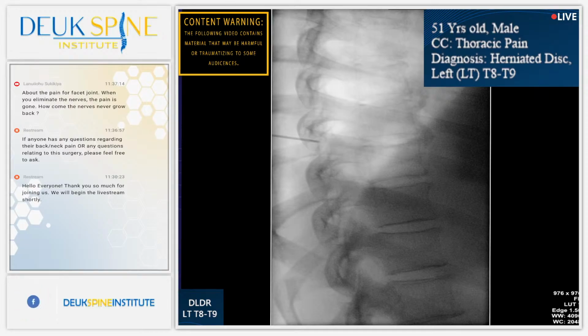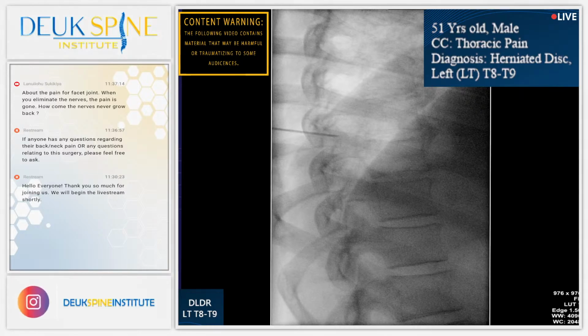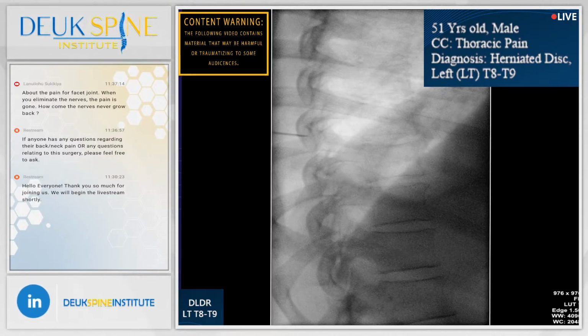Shot? All right. So far, so good. Our patient is comfortably resting. I've just got to get around this posterior facet complex and we should be all right. Lay still. Shot.